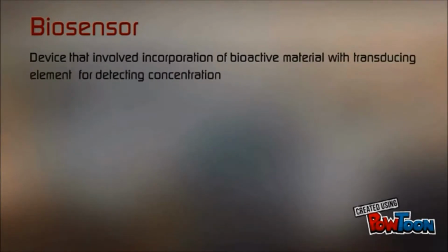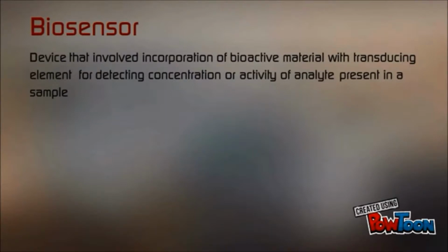So what is a biosensor? A biosensor is a device that involves incorporation of bioactive material with a transducing element for detecting the concentration or activity of an analyte present in the sample.